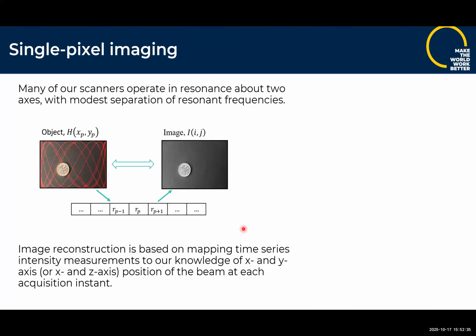just what can we learn about it just from what we're getting back as images? If I was doing a typical motion control problem, I would want to have a sensor on my actuator that's measuring, say, tilt angle as a function of time. I've just said, usually we don't want to take the space budget for that, but we are still getting some feedback. It's really a record of intensity as a function of time. And this is entirely how we're supposed to reconstruct the images of our devices.